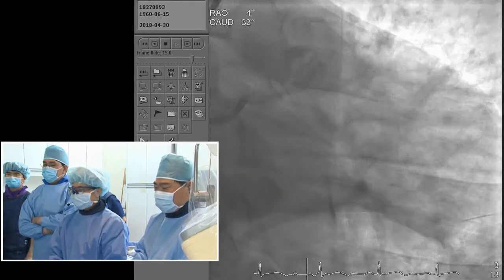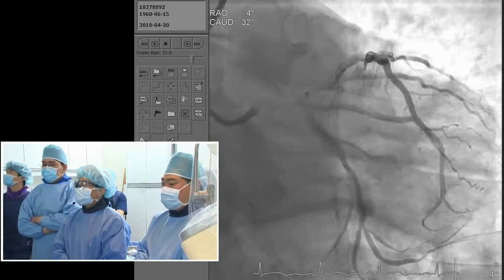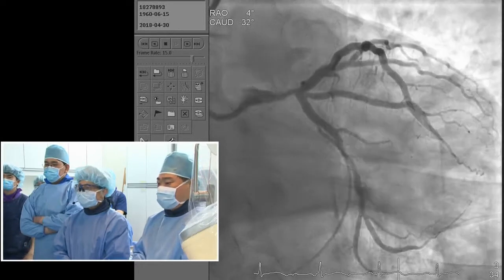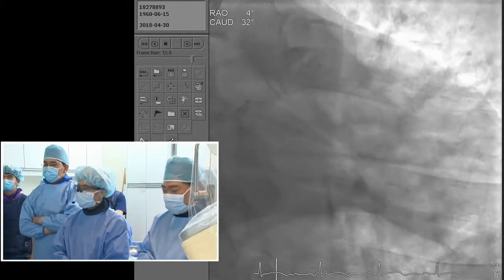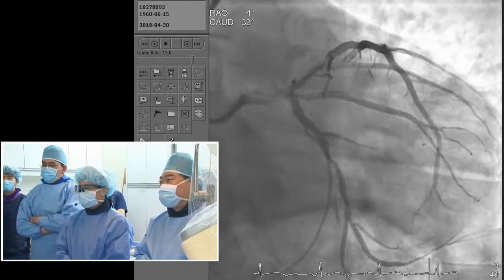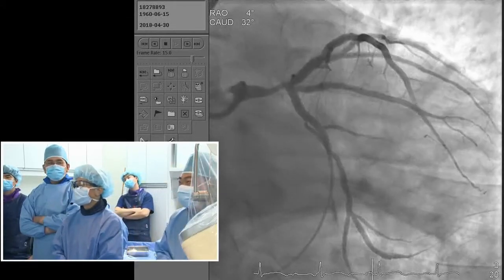In my opinion, if I have these cases, I would approach transradial. The right coronary artery must be negative by FFR. So you want to do that FFR first. The main disease is a quite visually tight stenosis, and I don't doubt too much about ischemia. Sometimes you need an FFR first to guide whether to treat or not. However, if you decide to treat this main disease, this is a very simple stent crossover, right? That is my opinion.